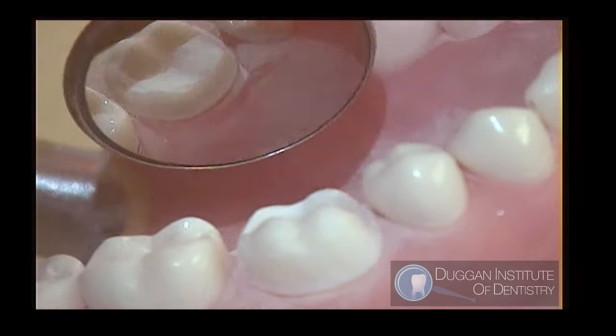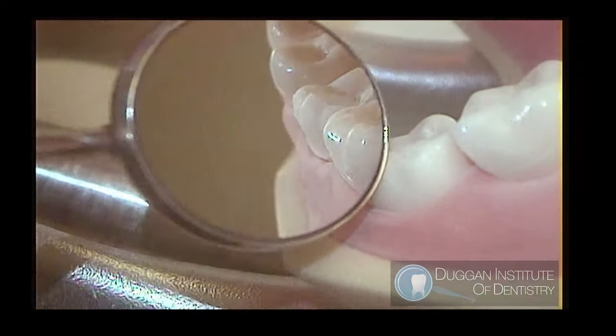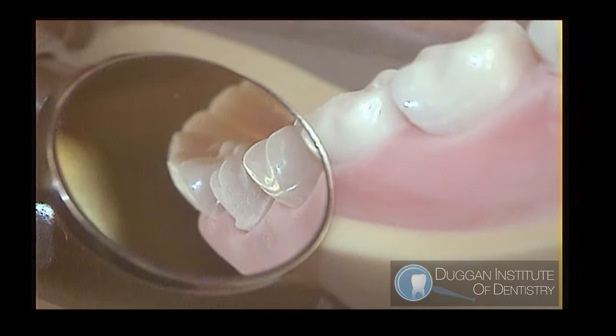Make sure to finalize the preparation by checking our measurements, taper, chamfer margins, and all-around function.